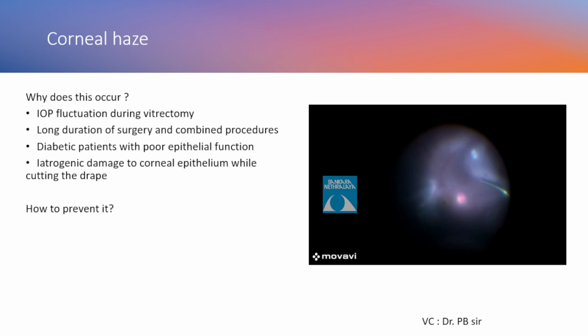So don't underestimate the fact that the epithelium may not heal easily in these patients, and especially when you're trying to use steroids, you're always concerned that the epithelium may not heal properly and can actually develop infiltrative keratitis. So try not to remove the epithelium easily. One way of avoiding it is in steps like what you have shown of doing vitrectomy. You don't need that crisp visualization. With that haze, I can still operate. You're only removing the vitreous gel.